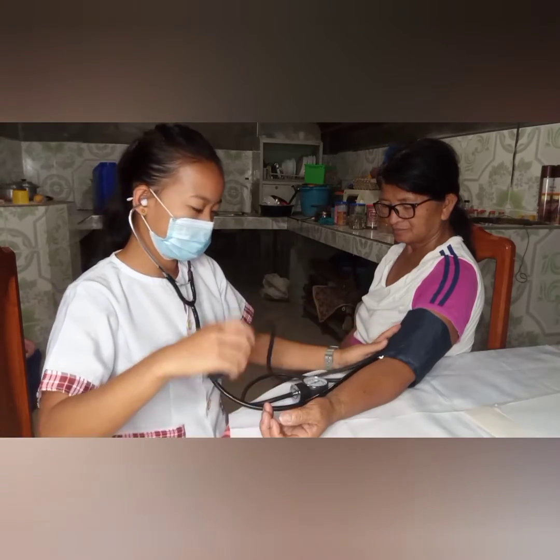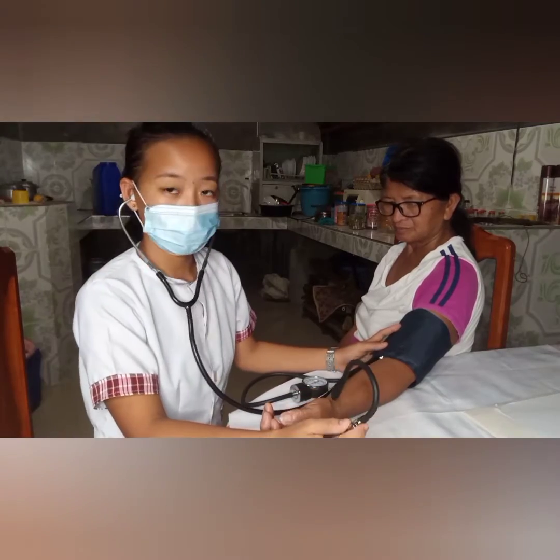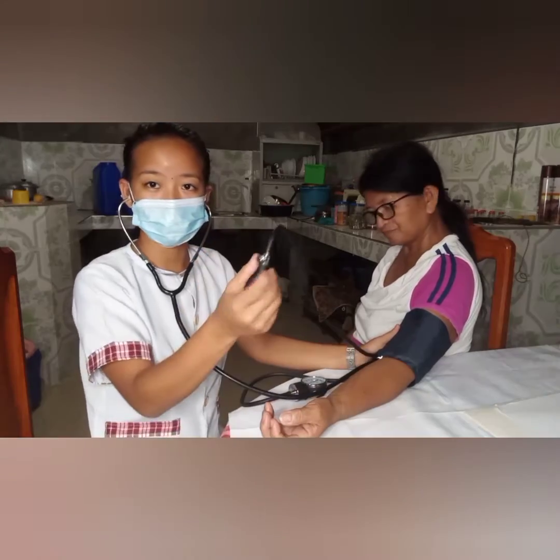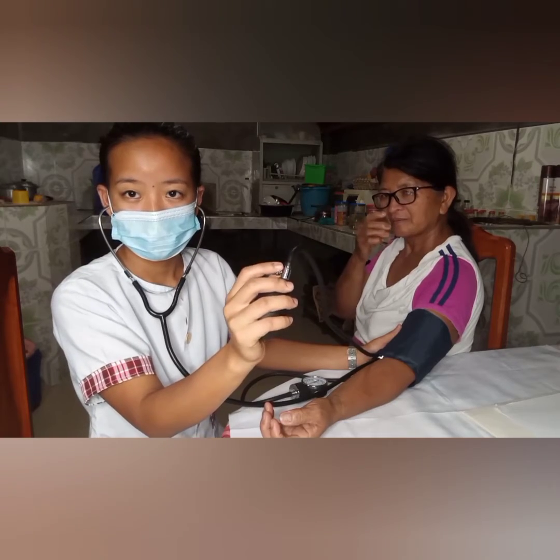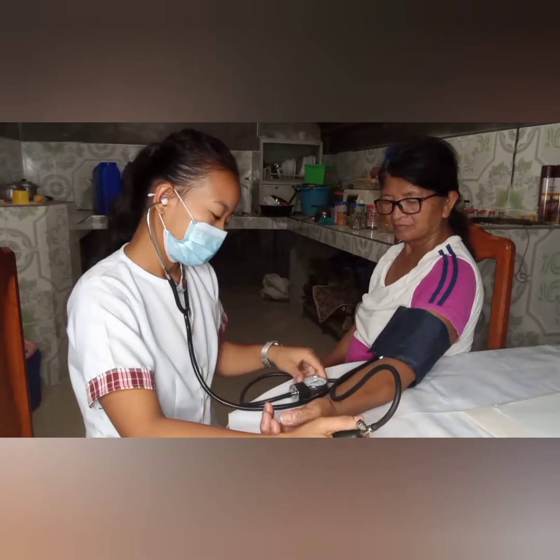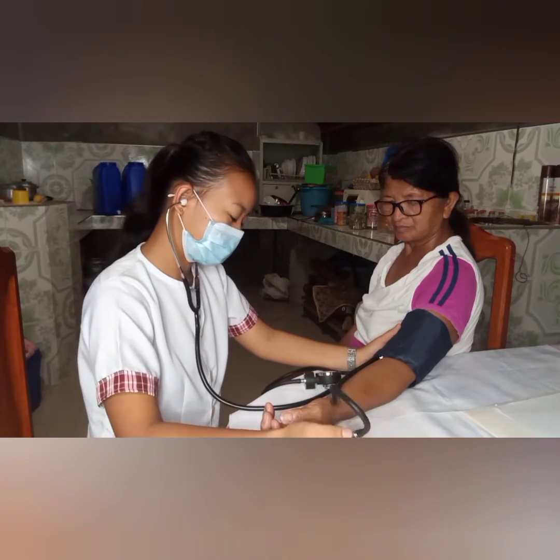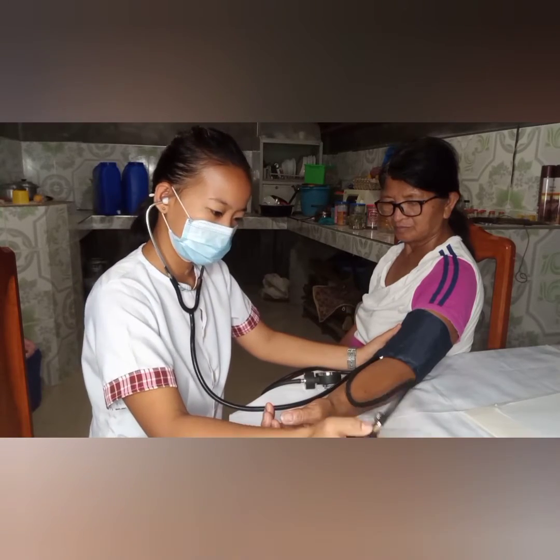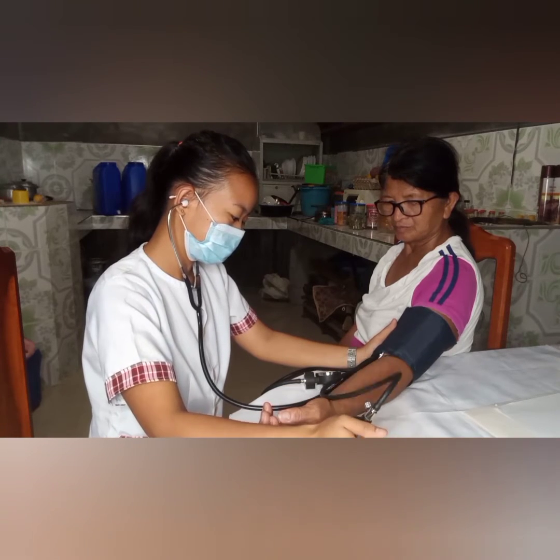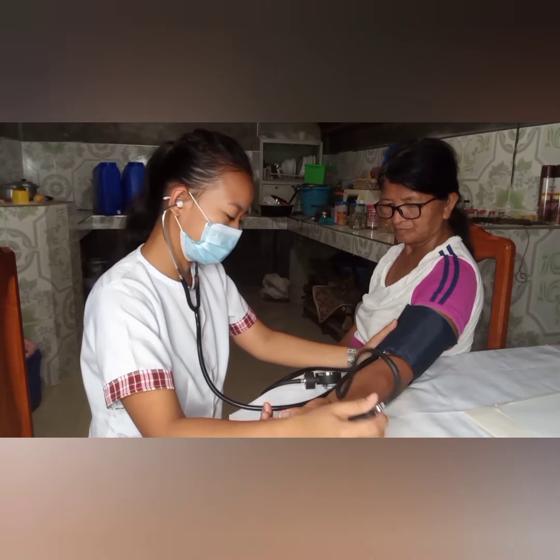And by using this part, this is the part where we can pump it and then get the accurate blood pressure. We have to lock this part. There's something small here that will lock the air going to this. So we are going to pump it until 130, and then I inflate it. Since it reached 130, we are now allowed to release it.